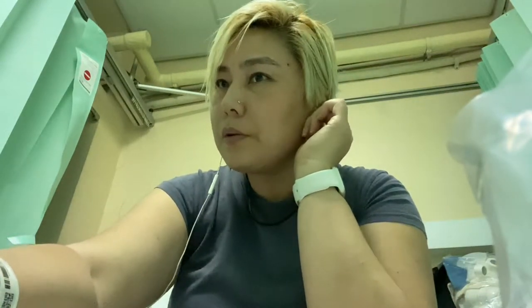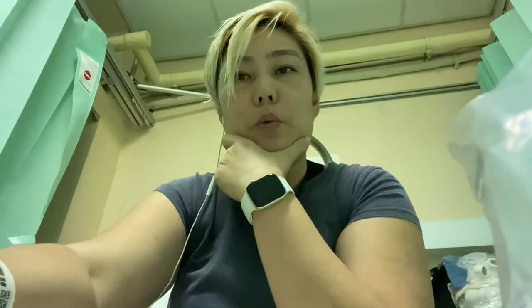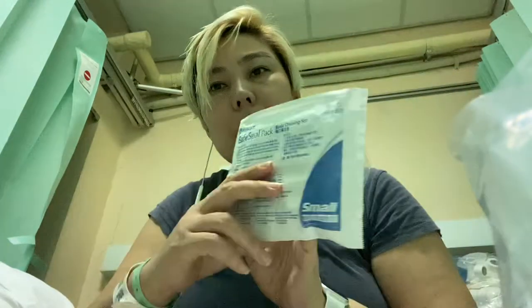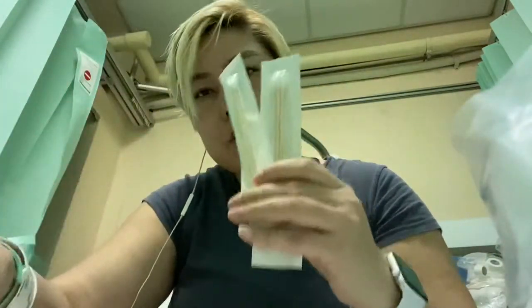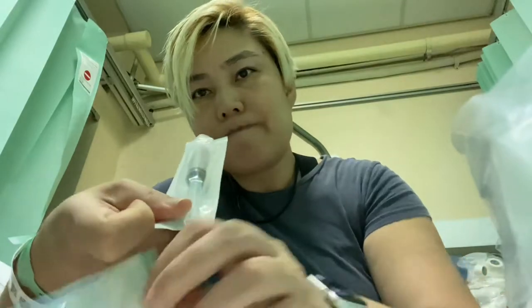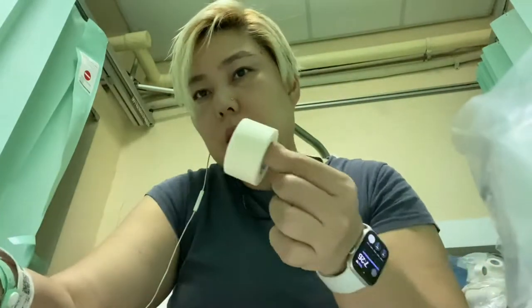Hello guys, this is Jenny. I'm gonna show you how to do dressing for your OI leg. Here's the basic dressing set, and then two solution, two applicator, and syringe, and tape.